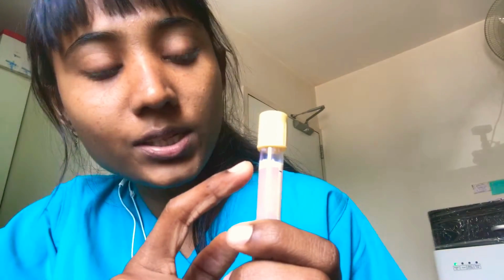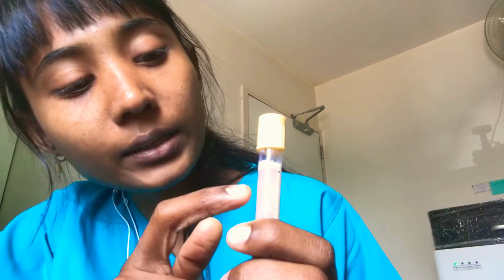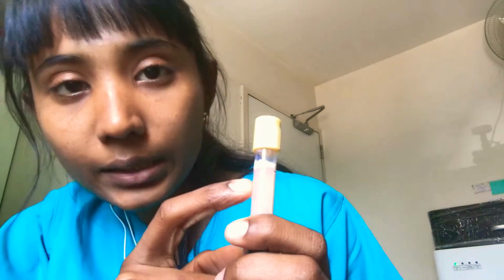This is usually done by refrigerating the lipemic serum overnight, followed by high speed centrifugation. By doing that, you will be able to separate the creamy layer, which is rich in triglycerides and chylomicrons, at the top, leaving the clear serum in the bottom. So for analysis, you can use the clearer serum.